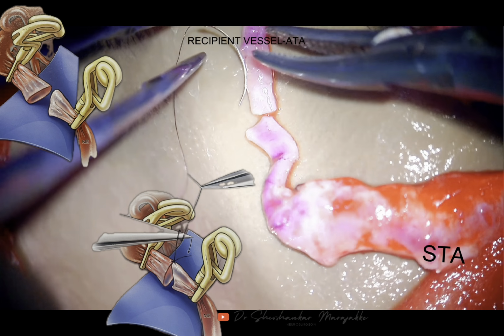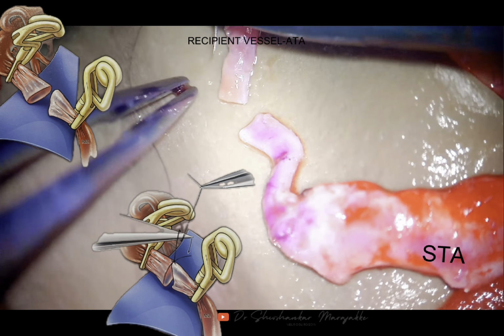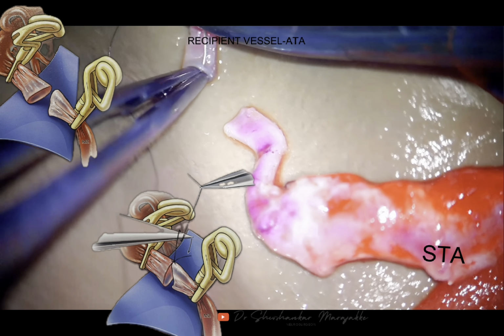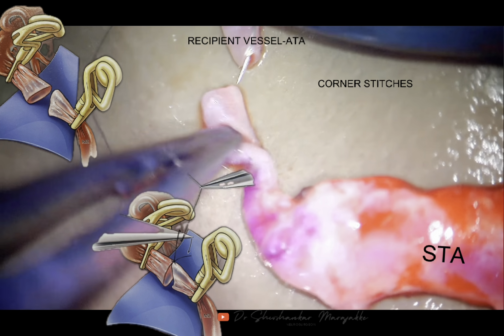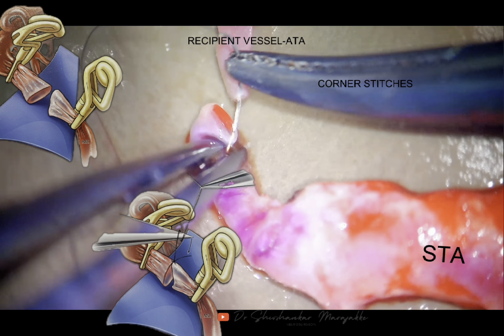Whereas arterial transections associated with this end-to-end anastomosis give it a circular, vertical orientation that yields deeper and more complicated suture arcs. So it is quite difficult compared to side-to-side and end-to-side anastomosis.